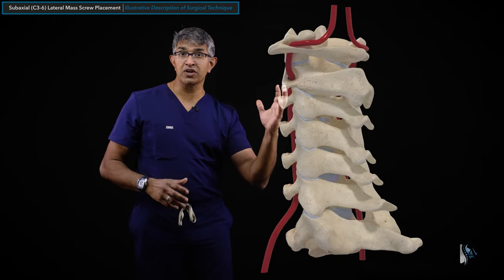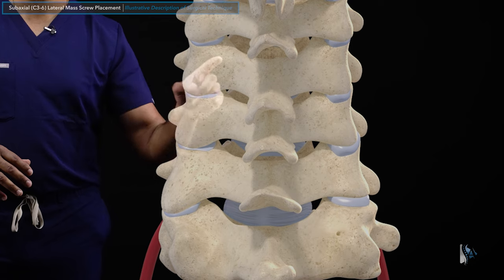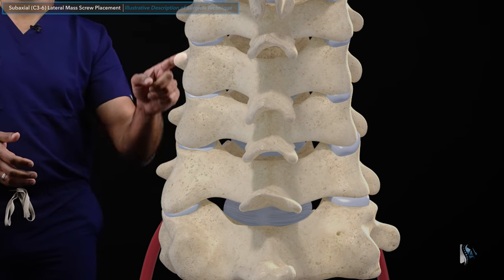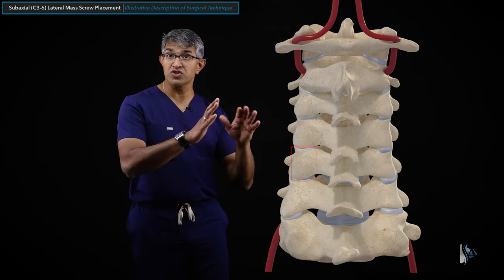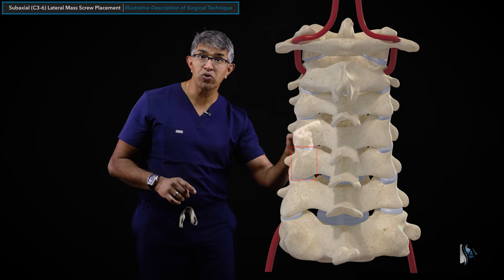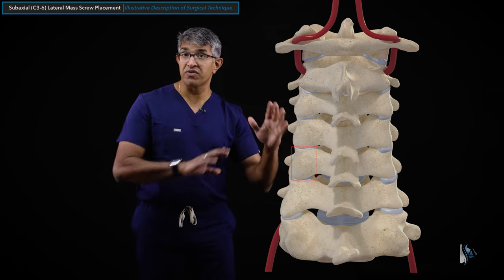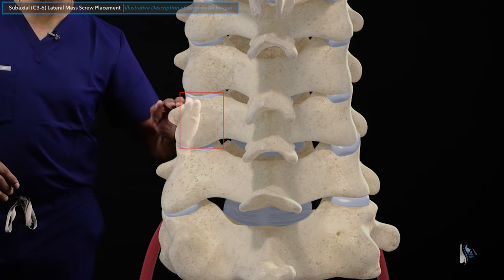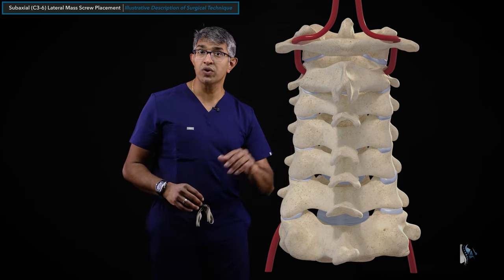If you spin the image around and look from the back, you can see the spinous processes, the lamina, and this lateral mass structure just to the side of the spinal canal. It's a paired structure - a stack of lateral masses on each side from C3 all the way down to C7. From the back, this structure looks roughly rectangular. Each one is rectangular, with the medial border dictated by the junction of the lamina and lateral mass, a well-defined lateral boundary, and the superior and inferior articular processes forming the cranial and caudal borders.